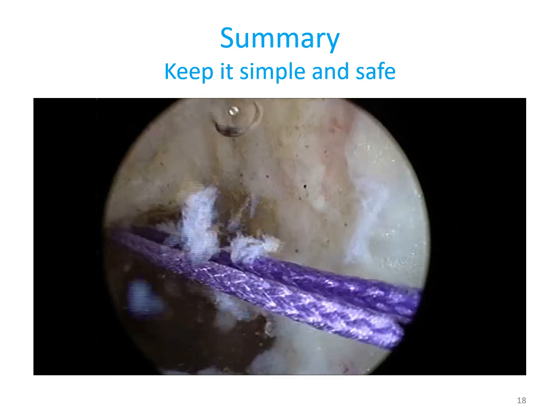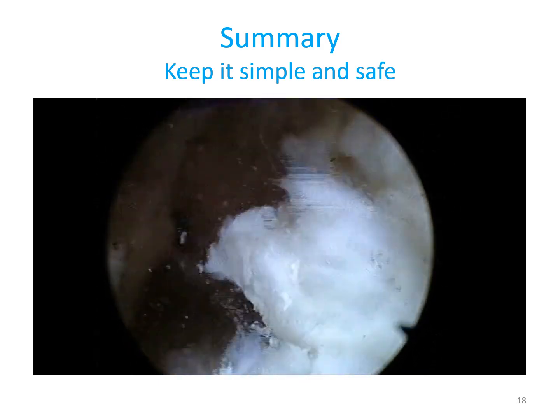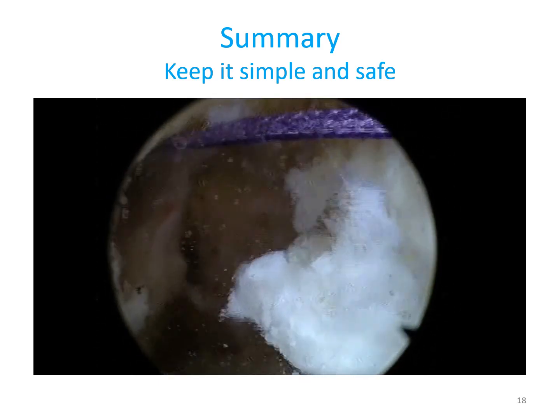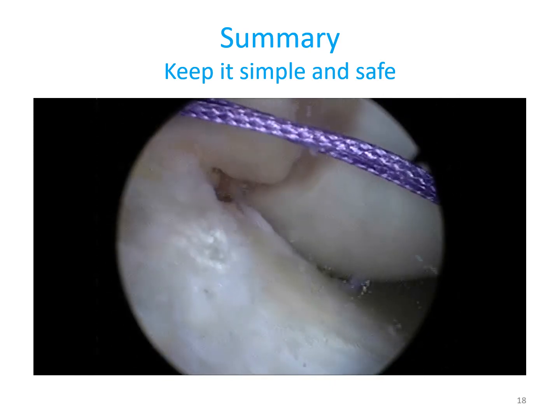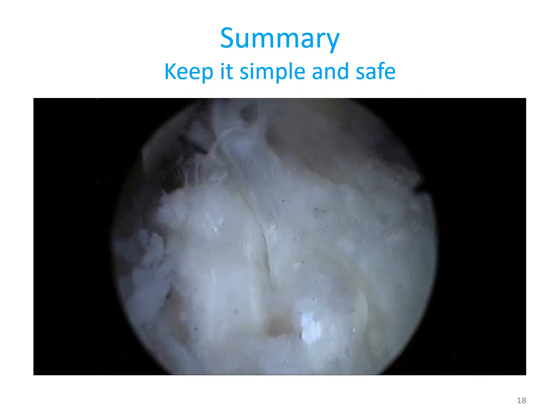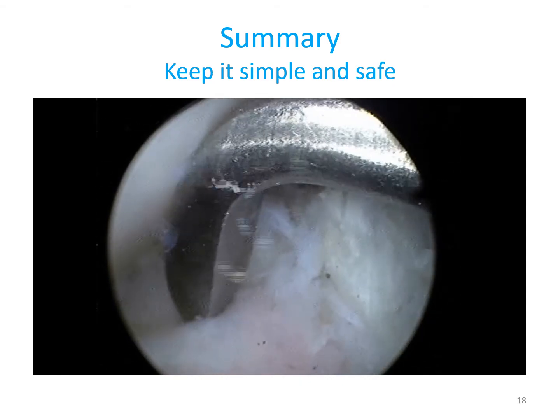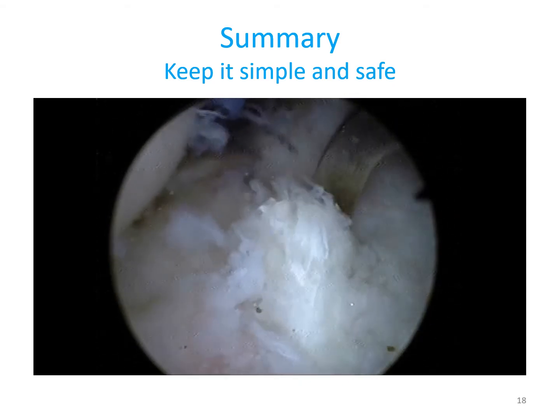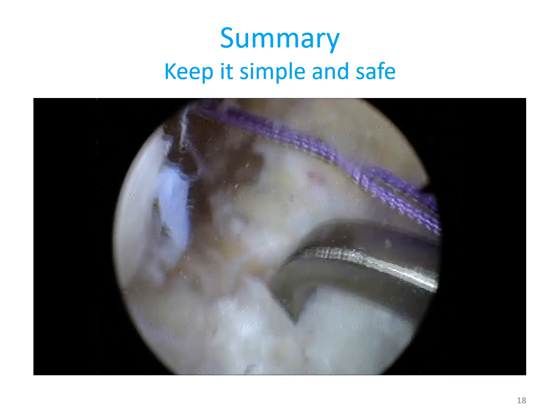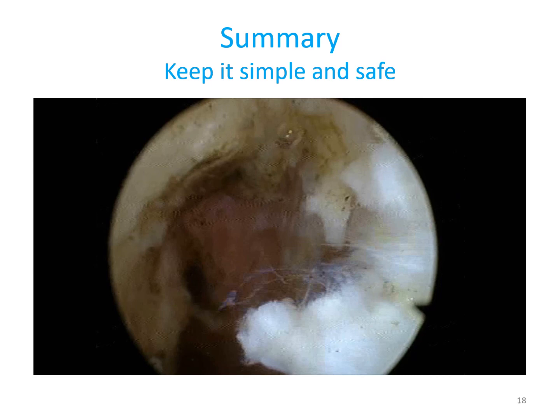Do a transportal drilling so you have a horizontally oriented graft. This is the femoral drilling, and this is the proper anatomic femoral point for the ACL. And again, on the tibial side, this is the right knee looking from the anterolateral portal. This is the posterior edge of the anterior horn of the lateral meniscus. Just feel the medial tibial spine, be just lateral to it, and leave as much of the native collagen fibers of the ACL that you can leave for proper collagen fill.